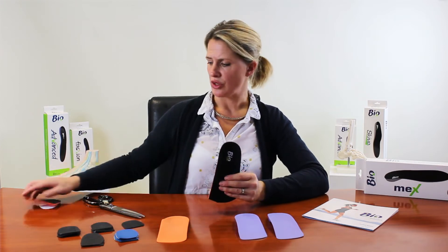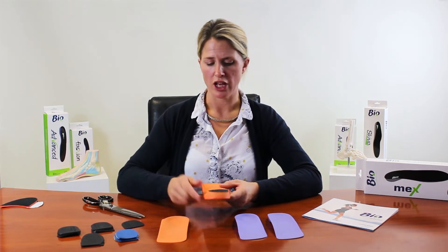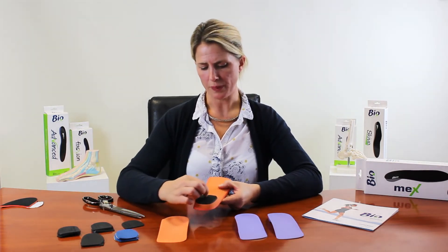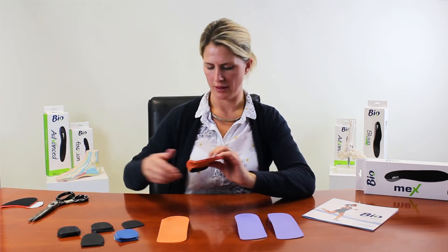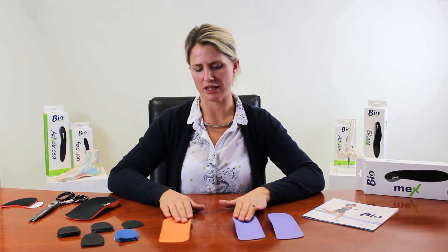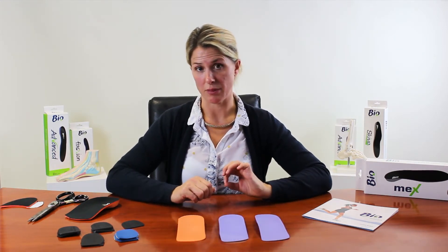If there are issues fitting these in footwear, you can trim around the sides further to make it even slimmer. You can also trim down your wedging and make it into a hemi post, which reduces bulk for footwear. Clinicians generally fall into two categories: those who like to customise extensively and those who are happy to use them as they come out of the packet — this product suits both approaches.